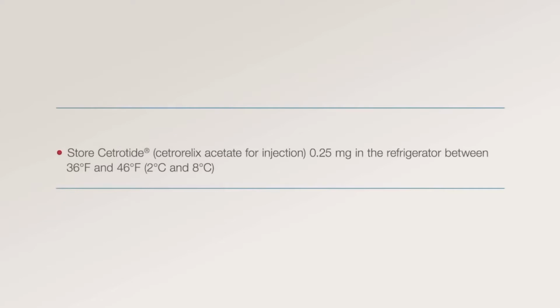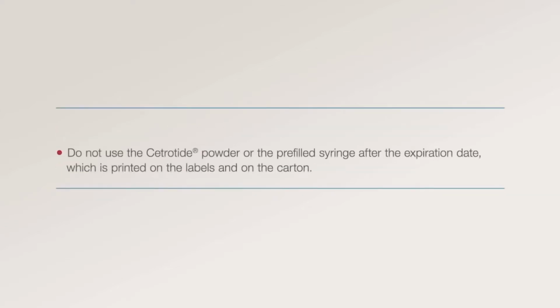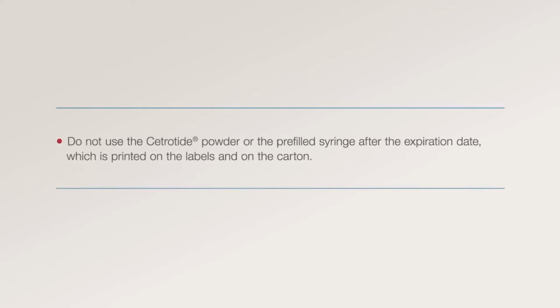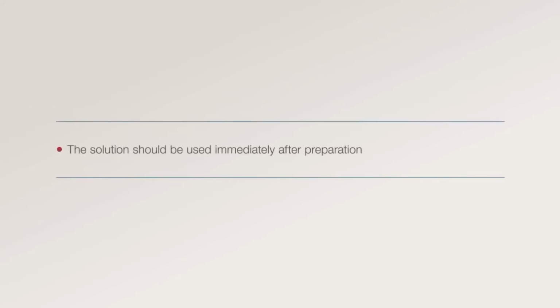Store Cetrotide 0.25 milligrams in the refrigerator between 36 and 46 degrees Fahrenheit. Keep the package tray in the outer carton in order to protect it from light. Do not use the Cetrotide powder or the pre-filled syringe after the expiration date, which is printed on the labels and on the carton. Dispose of the vial and the syringe properly. The solution should be used immediately after preparation.